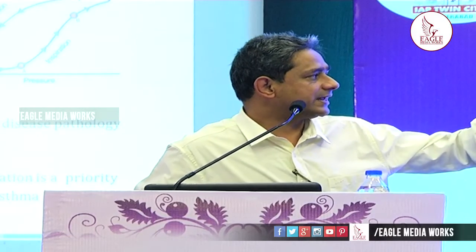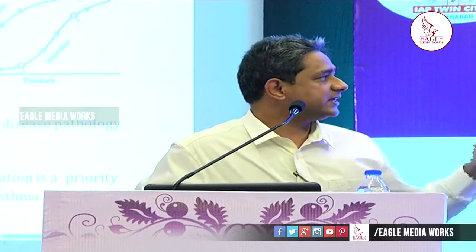So we discussed this PIP, PEEP. Again, you have this PV loop. In this PV loop, what is known as hysteresis, you can see the lower red dot, which is known as the lower inflection point. What is the lower inflection point? The point at which the alveoli open up. The horizontal line is the pressure, the vertical line is volume. Once the alveoli open up, there is a sharp increase in the volume. That is where the importance of keeping your PEEP comes in. So normally the PEEP is kept just above the lower inflection point.